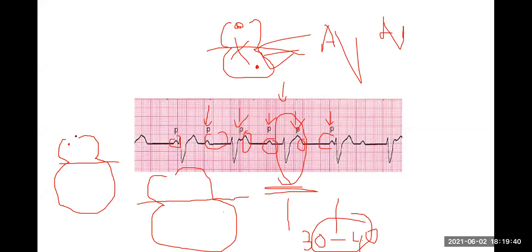In this heart, the escape rhythm is starting from here. In this other heart, the escape rhythm is starting from here. That happens in very severe disease. In this heart, the escape rhythm is closer to a normal, young heart, so it's starting close here.